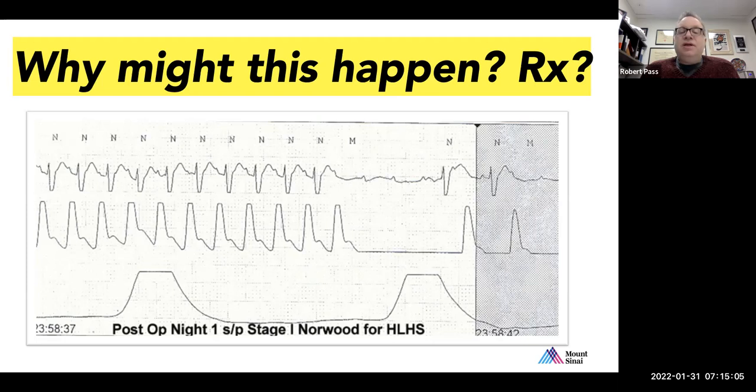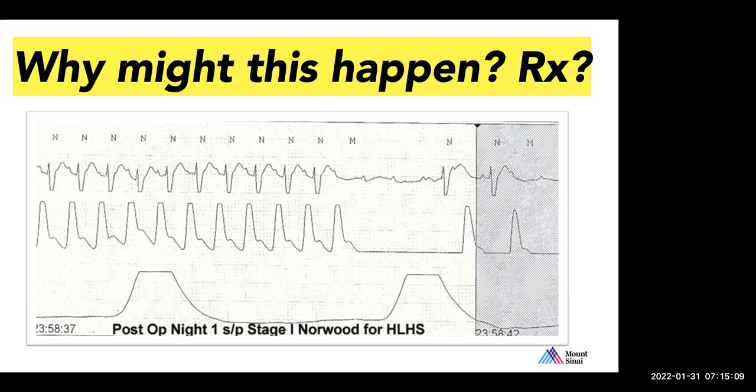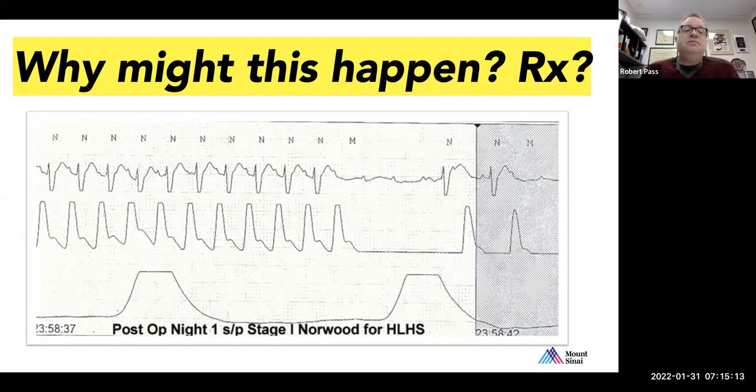So could you set this up in a dual chamber method to pace? Yeah, I think so, if we can sense the A well. Right, right. So you could just pace this patient DDD, and then only pace on the non-conducted P waves. So that would probably be a somewhat better hemodynamic result, I think.